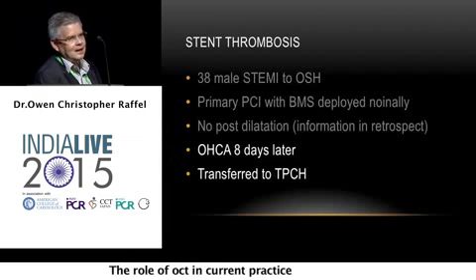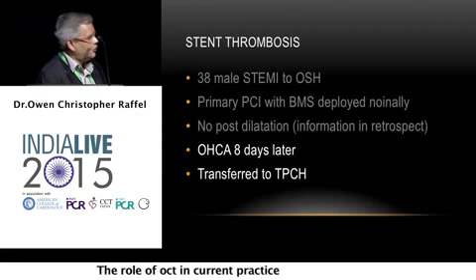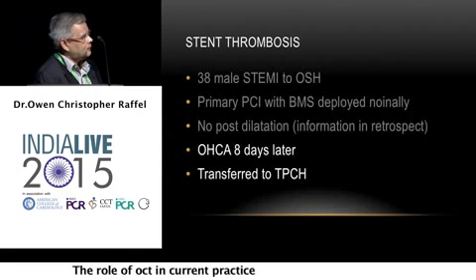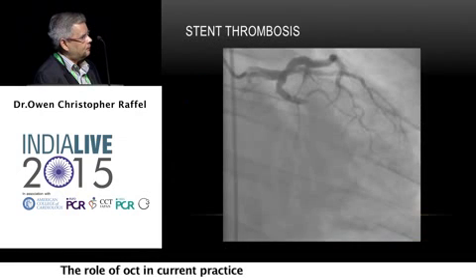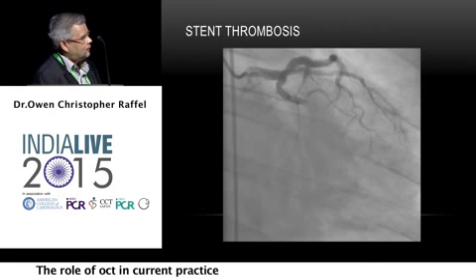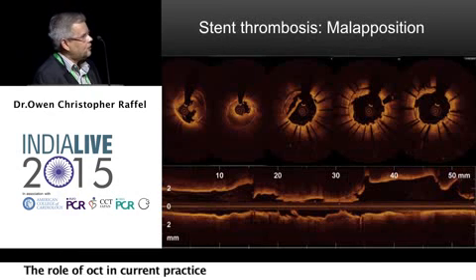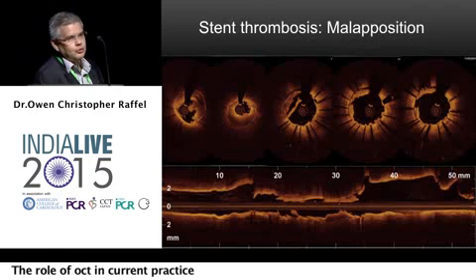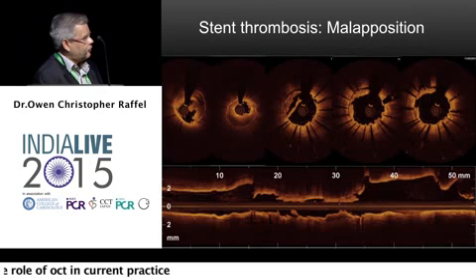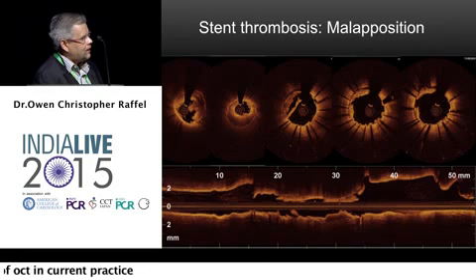8 days later, he had an out-of-hospital cardiac arrest while sleeping at his home, resuscitated by his wife. He was transferred to our hospital. And that's the angio. It's clearly occluded his stent. And this is the OCT. And this is very instructive. That's the long view, which is also very, very useful. And this shows quite clearly a lot of thrombus and proximally clear malapposition of the stent with the malapposed areas lined with thrombus. And this was clearly the nidus.